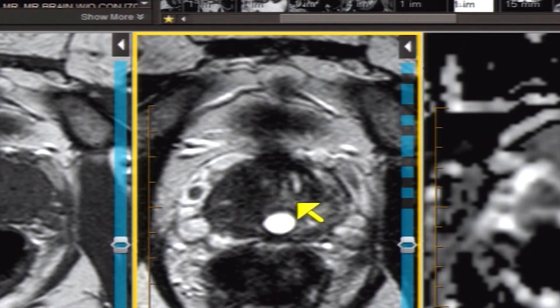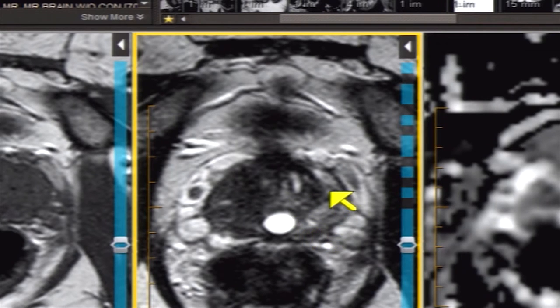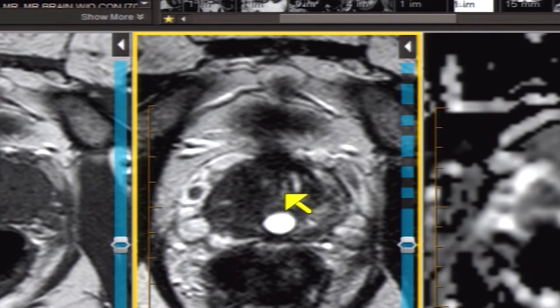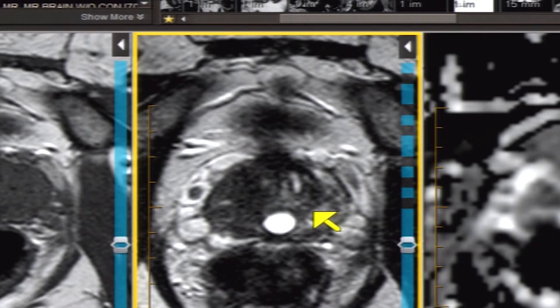In the right portion of the gland we see heterogeneous signal intensity. Let's take on a little anatomy: this sharp interface of a darker area towards the midline in the normal left part of the gland is known as the central region of the prostate. Within this region lies the transitional zone, which is more around the urethra, and the central zone — both incorporated into this central region.